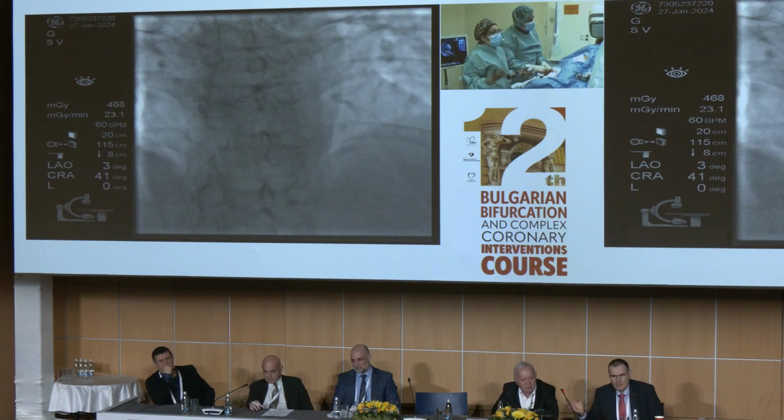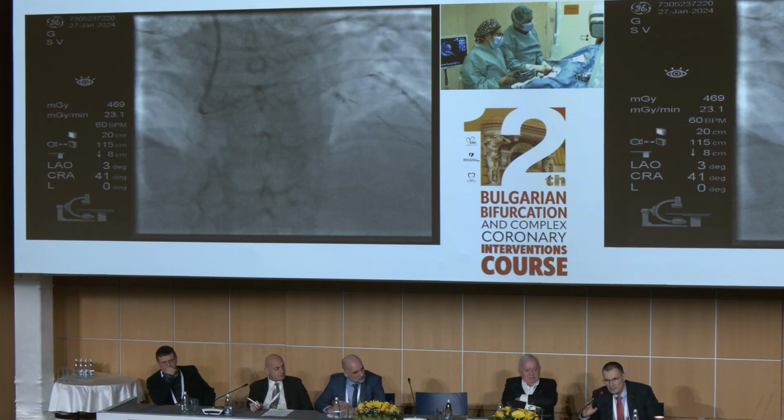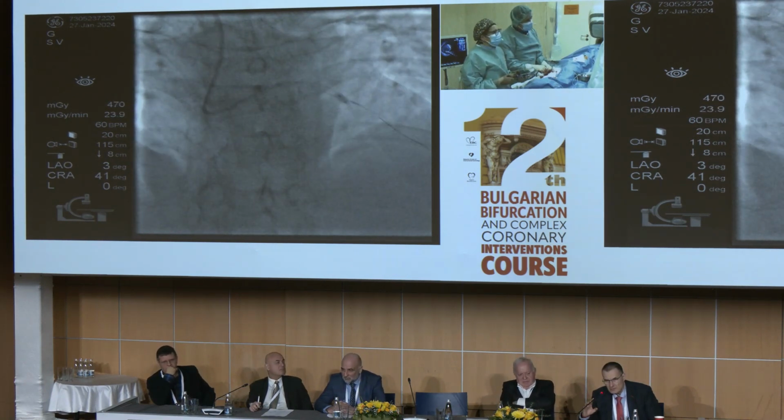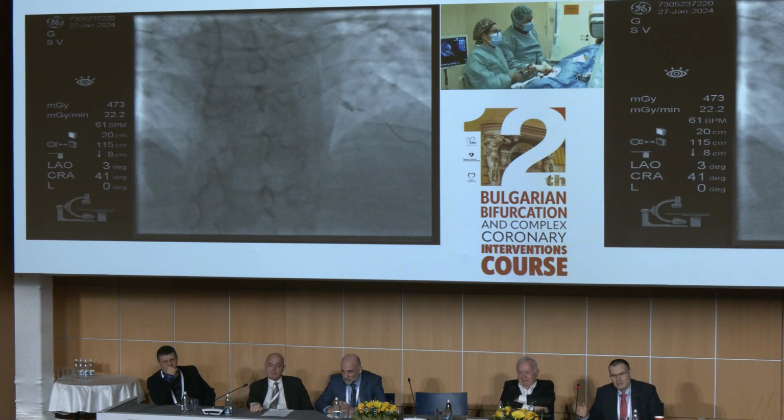Okay, we are still here. Let's deflate. What pressure are you at? 16. Let's go a bit more. 26 is 3.5. Let's deflate and let's try to go a bit more. Nothing distal will happen because it moved.